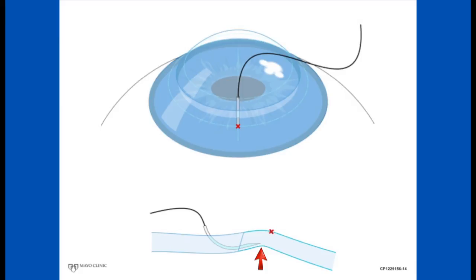First, we use the needle holder to rotate the tip of the needle 90 degrees on its axis from its initial position parallel to the host posterior surface.